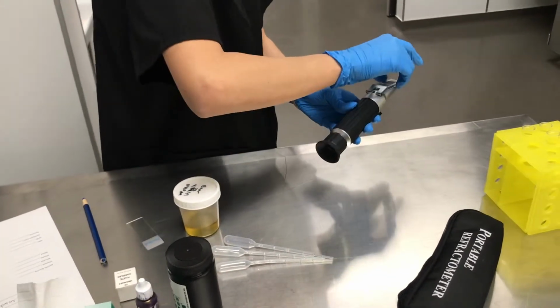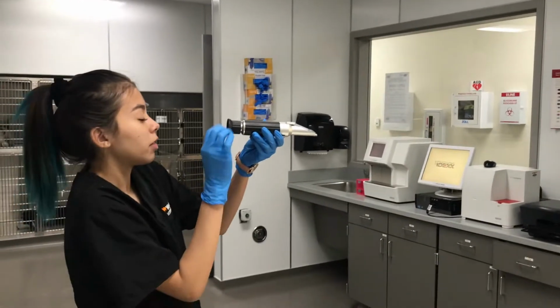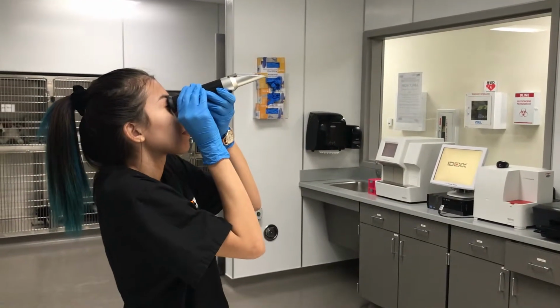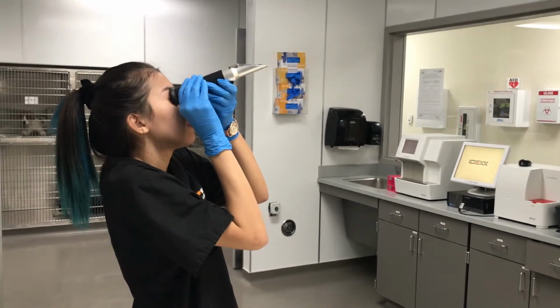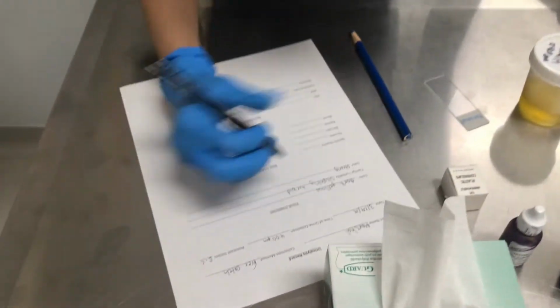And I will look into the light, and I'll read the right-hand side under where it says UG. And the specific gravity is 1024. So I will write that on the patient's record.